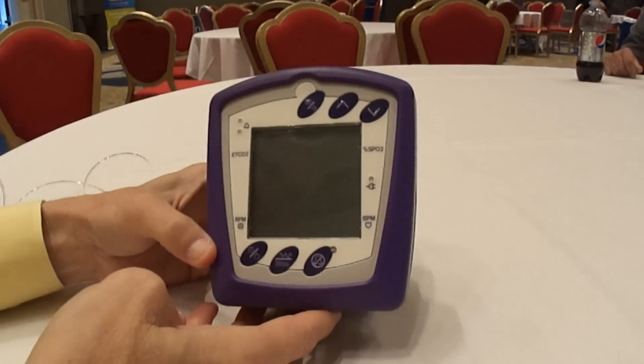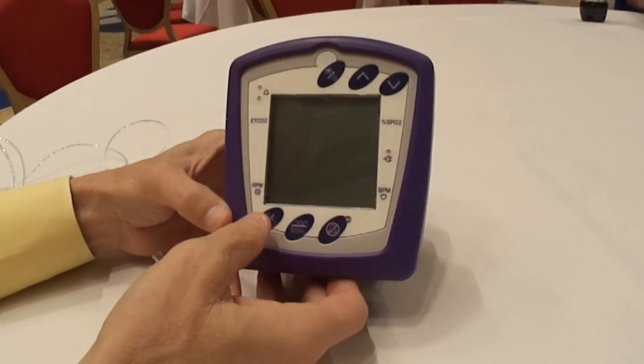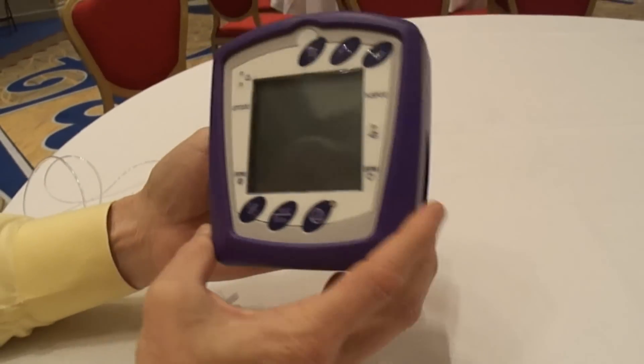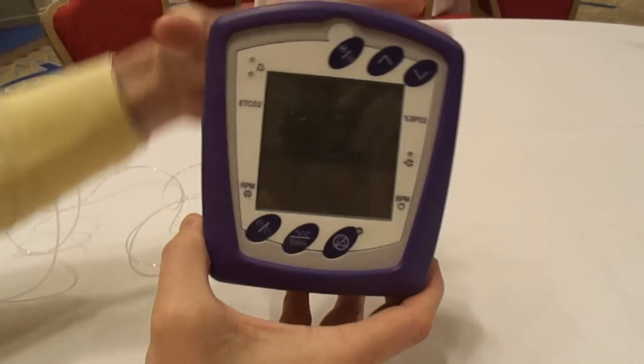This is the Capnocheck 2, an end-tidal CO2 monitor from BCI. Basically, there's a couple things to the unit. The unit comes like this with a purple rubber boot on it.